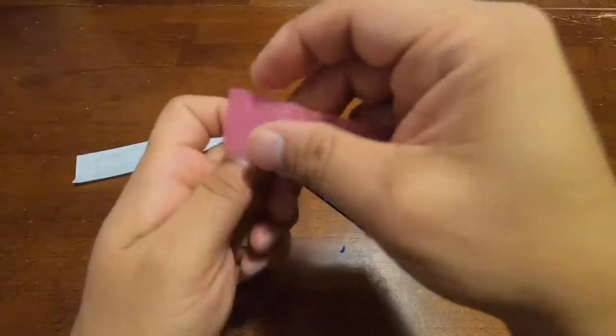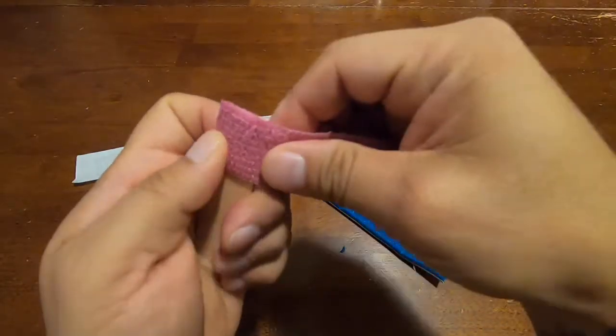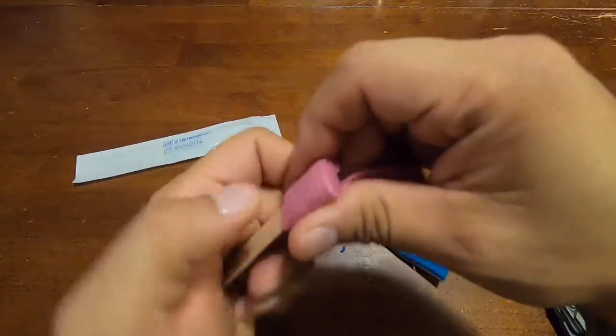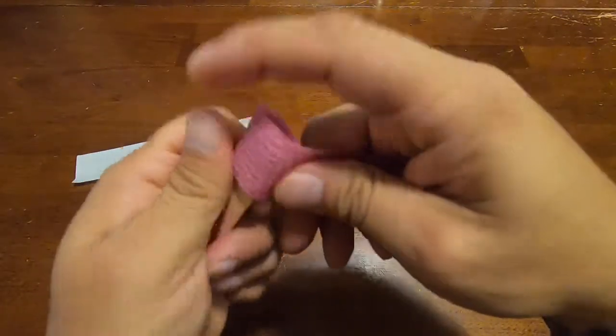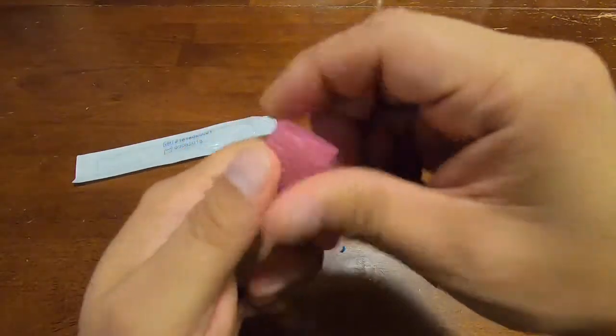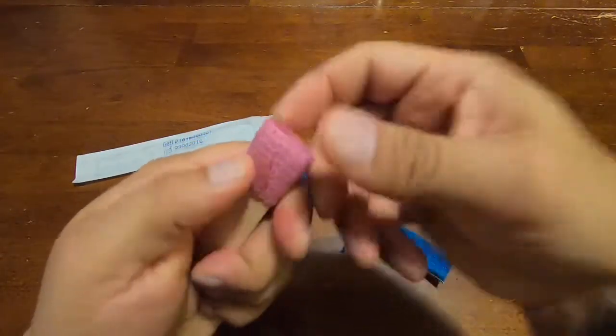All right, there we go. So now you'll just cover the end like we did with the aluminum splint, and there we go, just wrap it around the end.